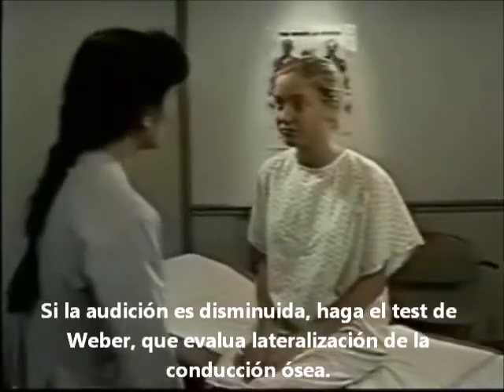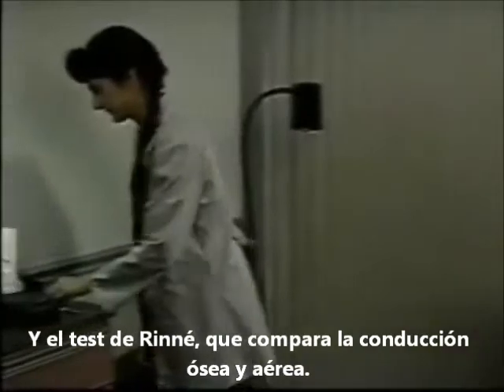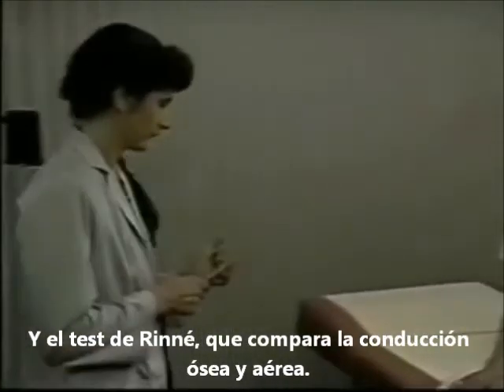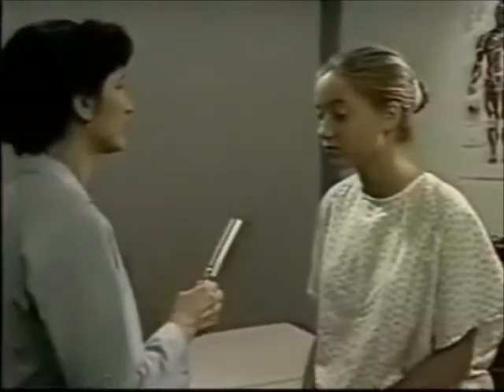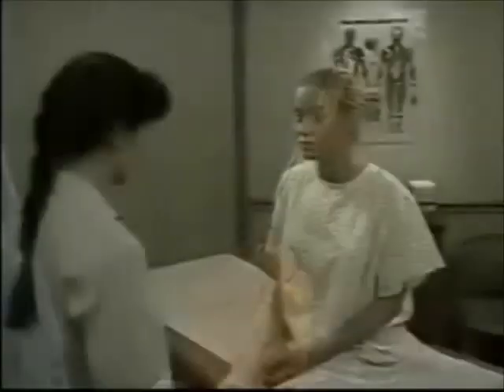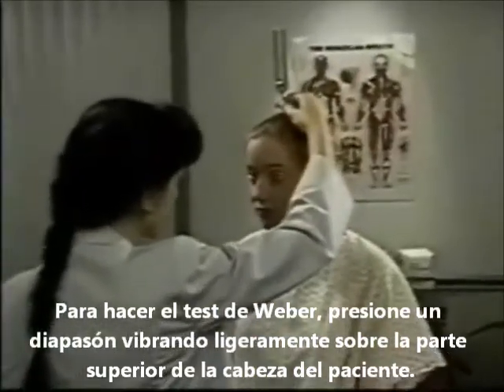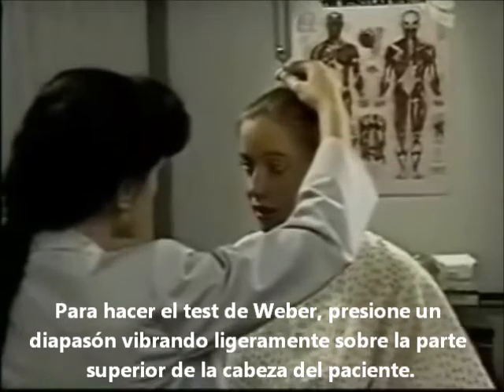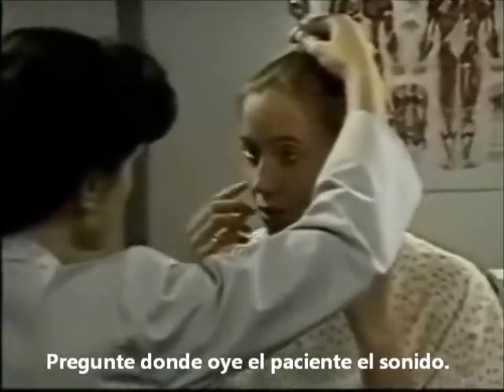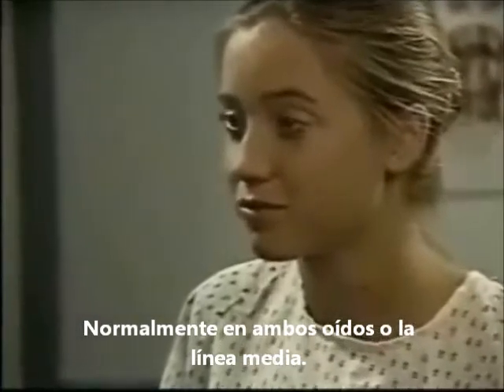If hearing is diminished, do the Weber test, which checks for lateralization of bone conduction, and the Rinne test, which compares air and bone conduction. For each test, use a relatively high-pitched tuning fork, such as one of 512 Hertz. To do the Weber test, place a lightly vibrating tuning fork firmly on top of the patient's head. Ask where the patient hears the sound, normally in both ears or the midline.